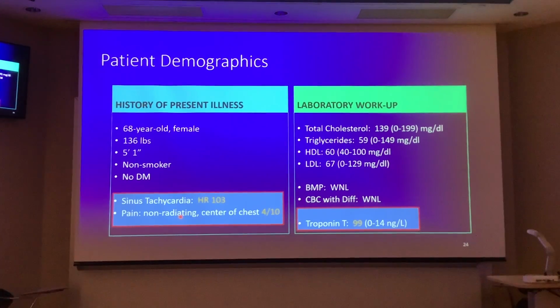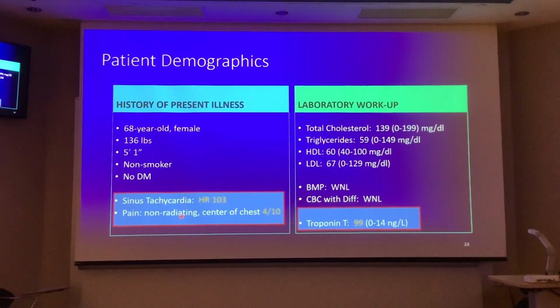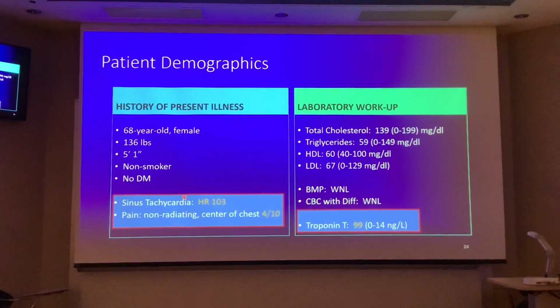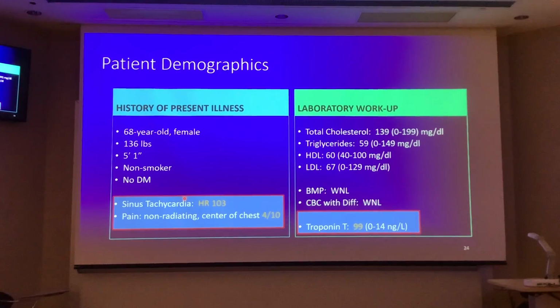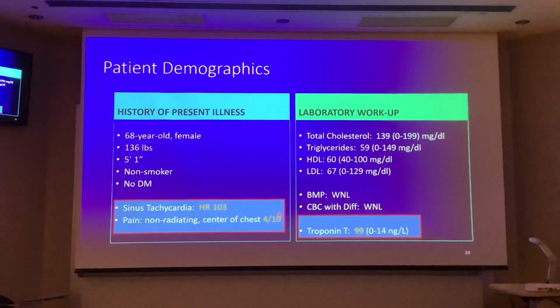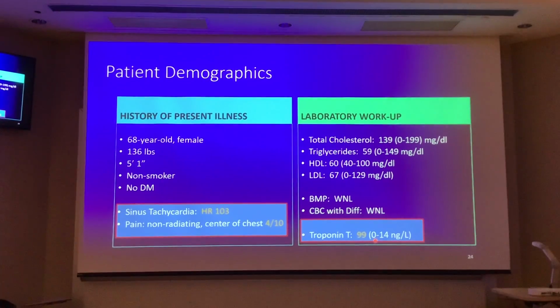But I left a loose end, and I try not to leave loose ends. The loose end here is that there was no abnormality seen in the left coronary arterial network. So how do we explain the tachycardia, the chest pain, and the troponin level in this patient?